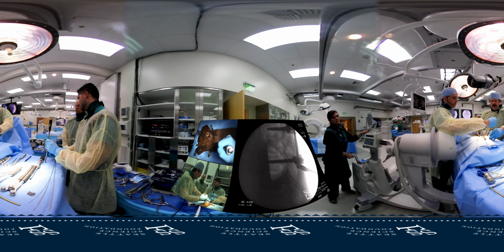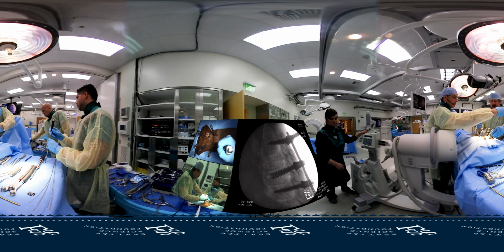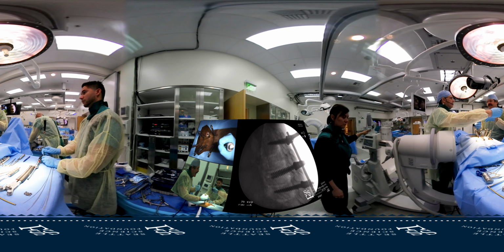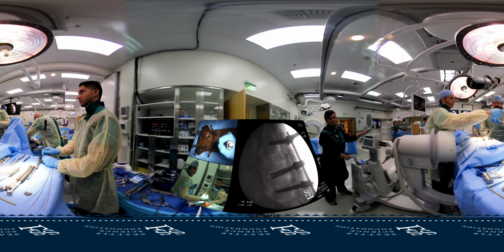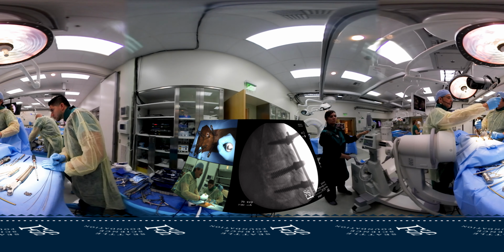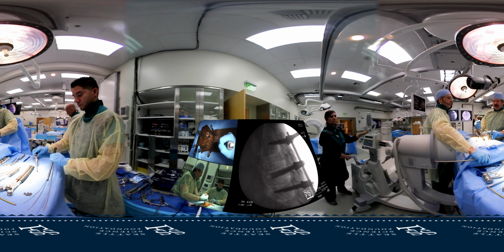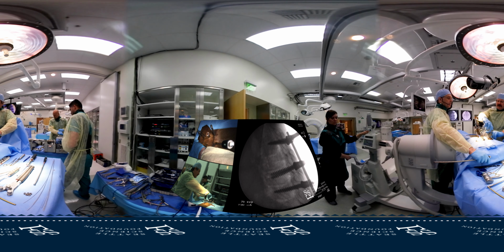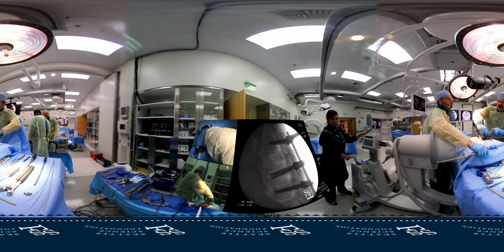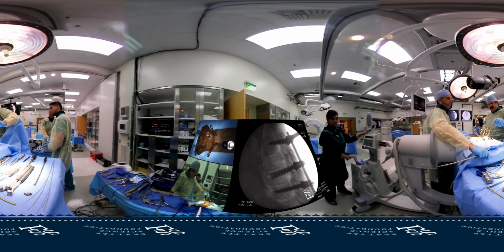Go ahead, North. How much manipulation room do you have now at this point in time? Is there still room for distraction or compression? Yes, all these MIS systems have their distraction compression devices, and we can do a little distraction or compression. You need to set a lever point outside the skin. Otherwise, you're just going to hit your two things together. You don't affect the screws. So you have to put something between these cannulas that blocks it so that the compression and distraction is felt by the screw. If you don't have something there, these hit, and all you do is connect your insertion devices.